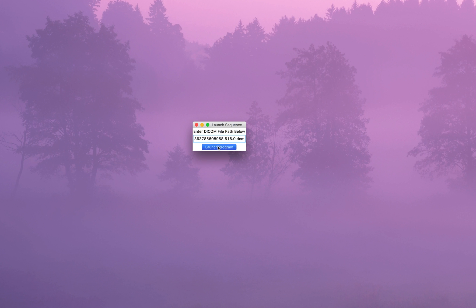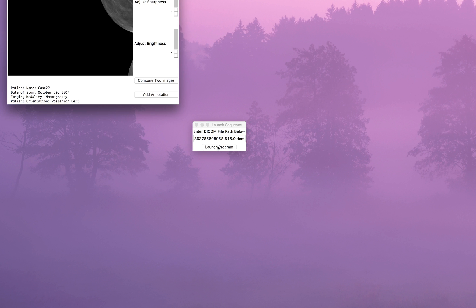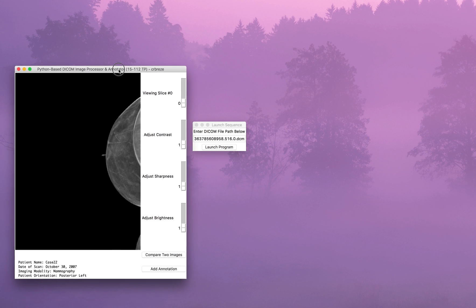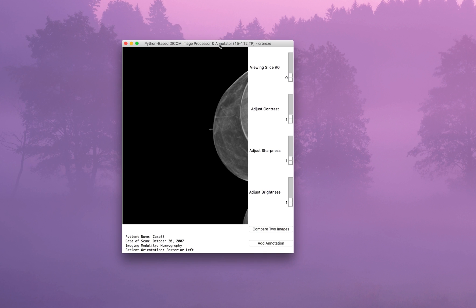Hi, my name is Cameron and this is my 15-1-12 term project. It's a basic DICOM image file viewer and manipulator. DICOM is the imaging standard format for many things like MRI, CT, and fMRI scans. This image viewer loads the image from a file which comes as a DCM file.